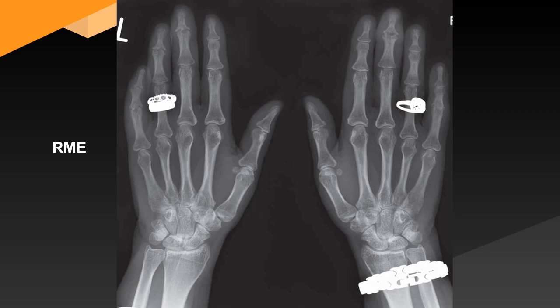The metacarpophalangeal joints and wrist joints appear normal, and the bone density is normal. I cannot see any resorption of the terminal tufts of the phalanges or any soft tissue calcification. There is marked soft tissue swelling around the right middle finger DIP joint. The patient has not removed their jewelry, and it is possible that pain and swelling prevented them from doing so.